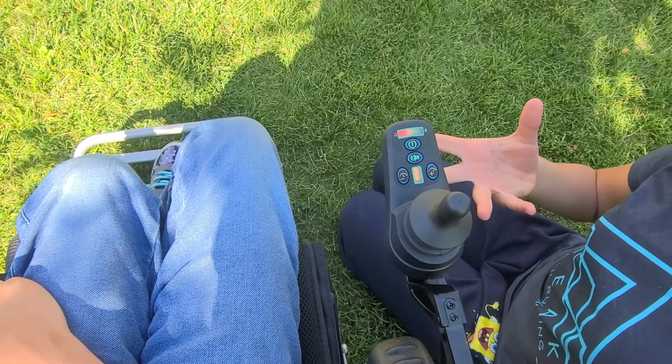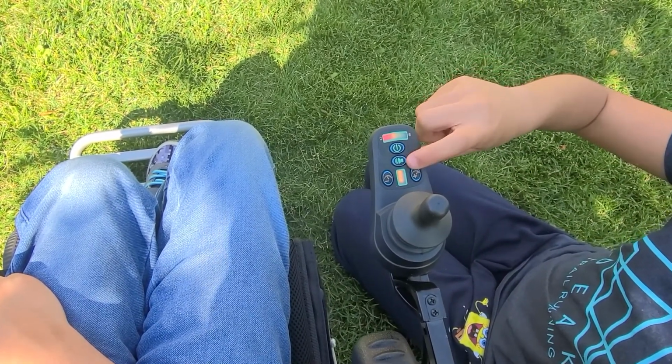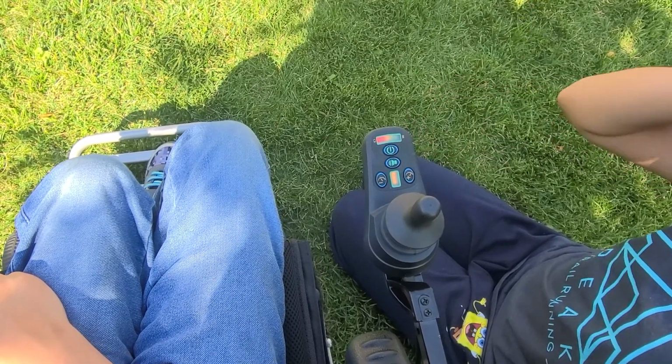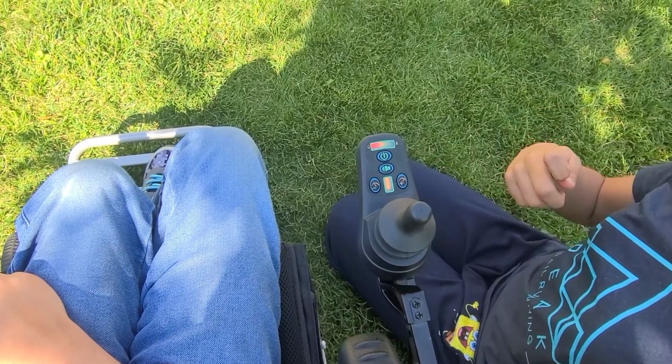Here are the main controls. Battery life indicator, on and off switch, horn. Here are the buttons that reduce and increase the speed.